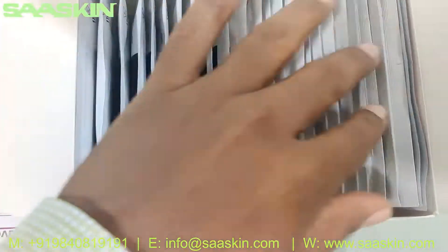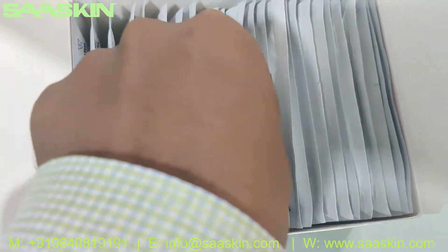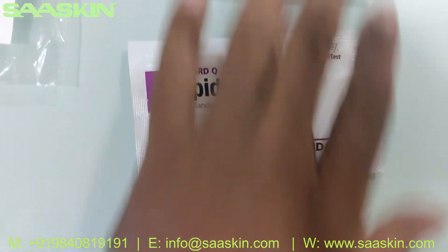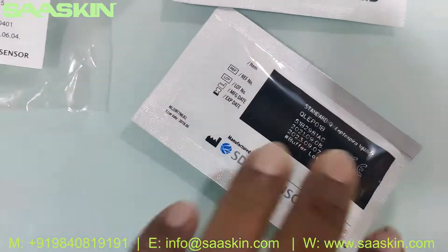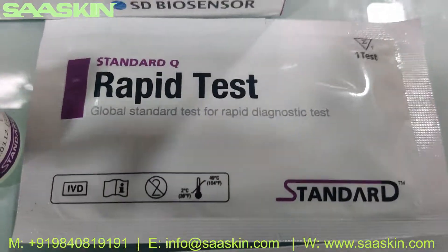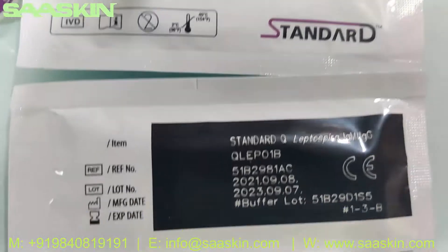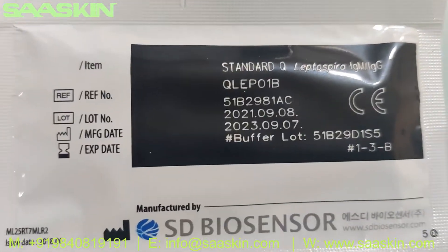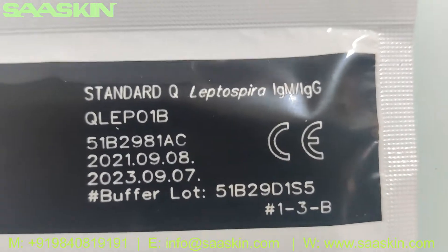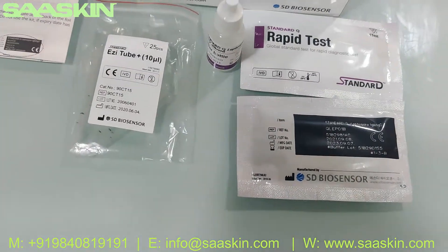You can see the test cassettes — 25 test cassettes. Let me take the cassettes out so you can see. You can see the two test cassettes — this is how the test cassettes look like. Here it is — it says Standard Q Leptospira IgM IgG. So this is the total content.